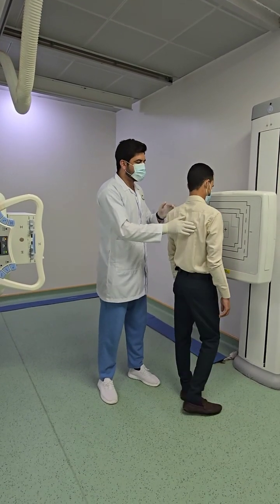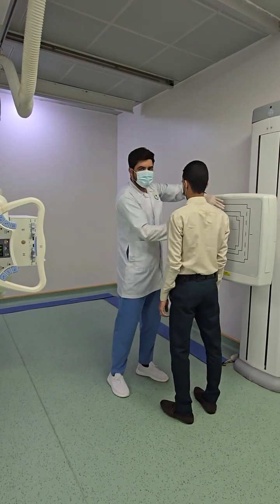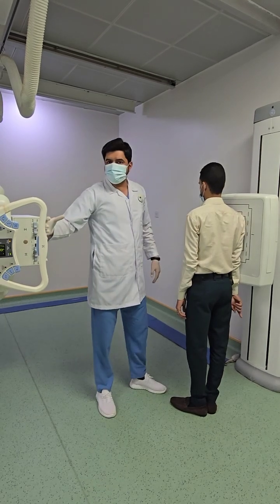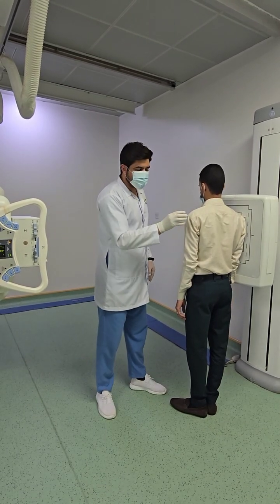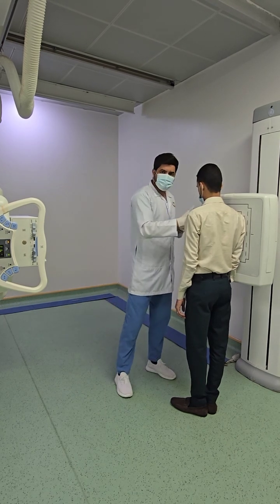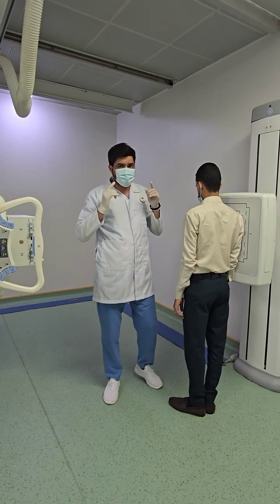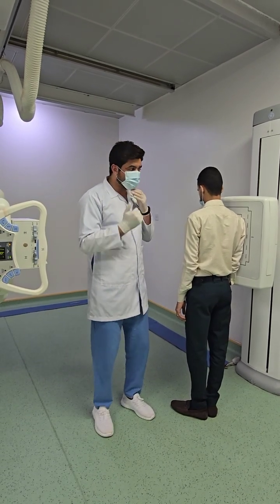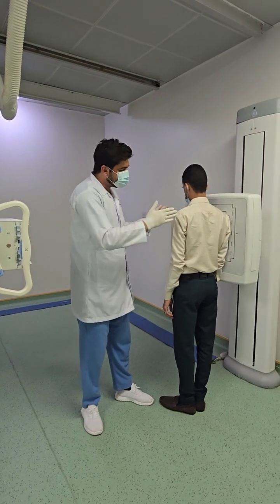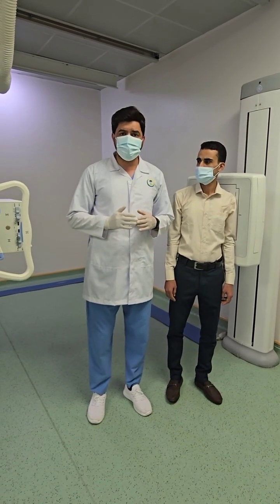In the right lateral, the right side of the body will be near to the detector or attached to the detector, and the X-rays will come at one side, interact with one side of the body, then will get in and will emerge from the other side of the body. But first keep in mind which side of the body is near to the detector. Right side is near to the detector. So right lateral view.